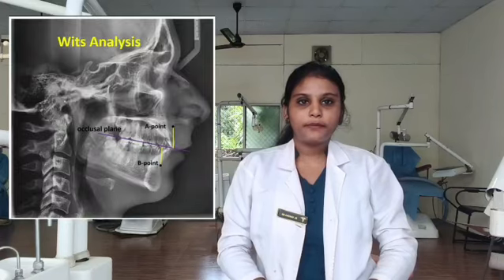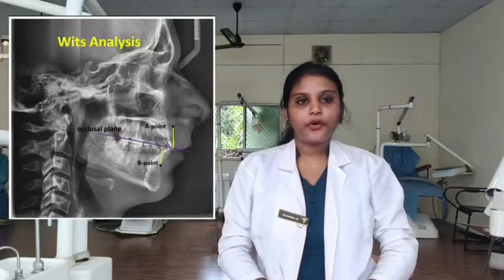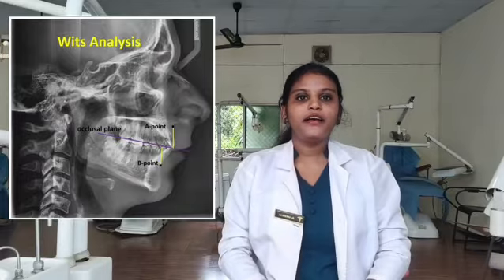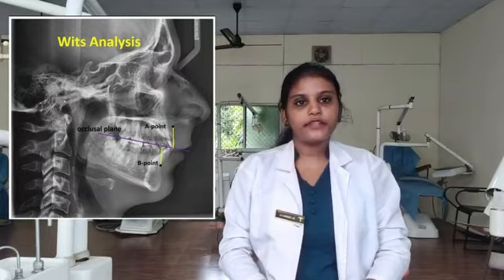For measuring the Wits Appraisal, draw a perpendicular line from the point A to the occlusal plane, that is the point AO. Then draw a perpendicular line from the point B to the occlusal plane, that is the point BO. Then measure the distance between AO and BO. This distance is called the Wits Appraisal.